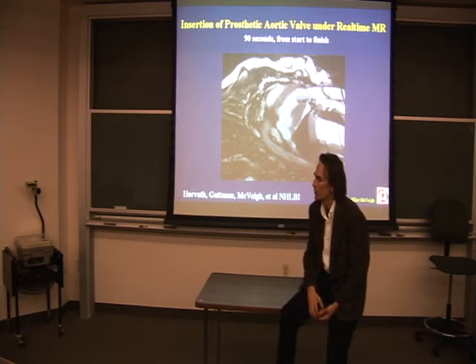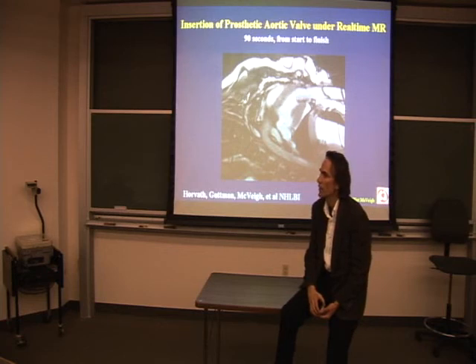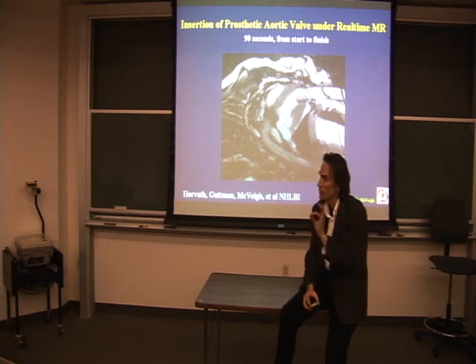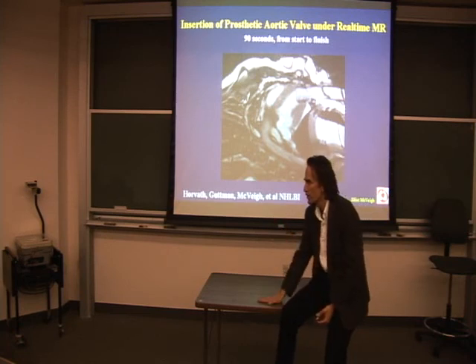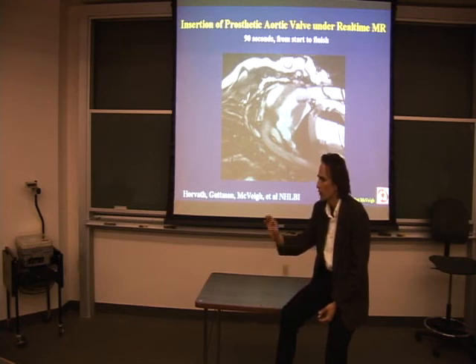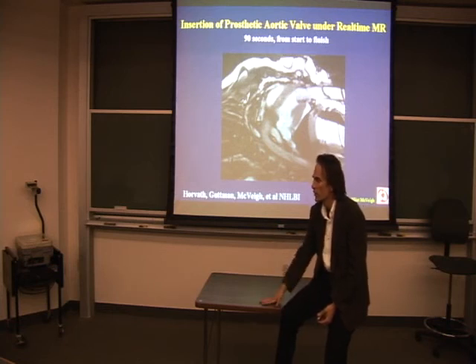And then the next issue is, once you can confirm that, can you image it in the atrial wall? There are some studies by Hannah Peters at Harvard showing very nice images of atrial ablation burns in the atrium, highlighted after contrast injection post ablation. Well, I think everything's there. It just has to be put together in a good package. The device has to be built, like what you did for the catheter with the marker.